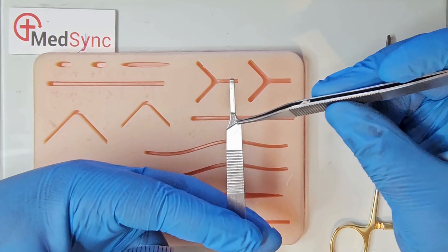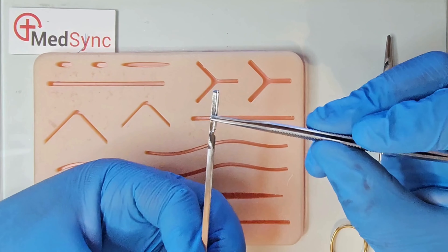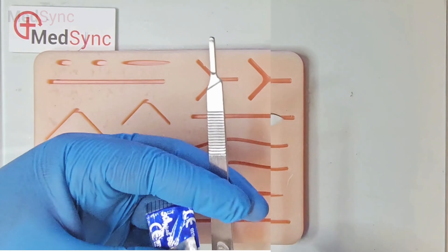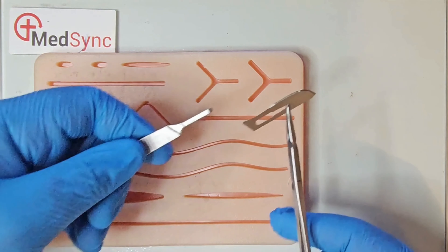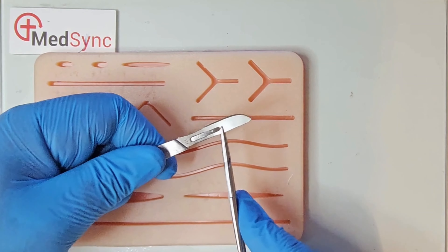You need to align the base of the blade to the correct angle on the scalpel. The key slot of the blade needs to align into the groove of the blade handle. Grasp the spine of the blade and advance it down the groove of the blade handle until locked in.